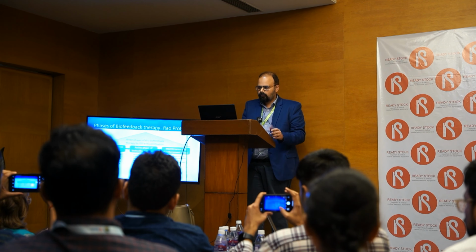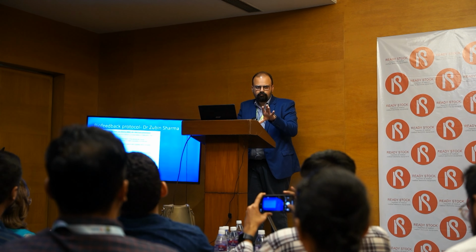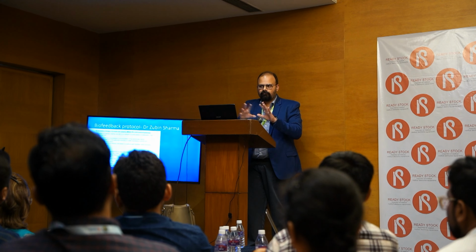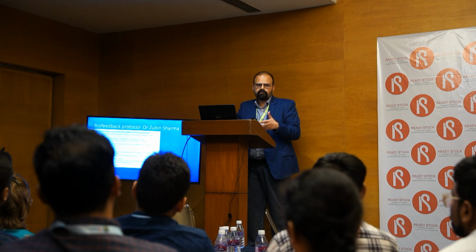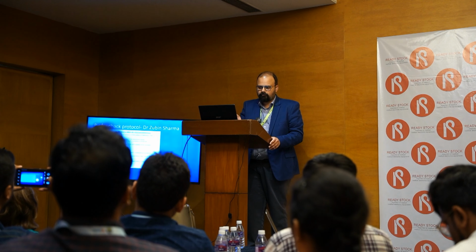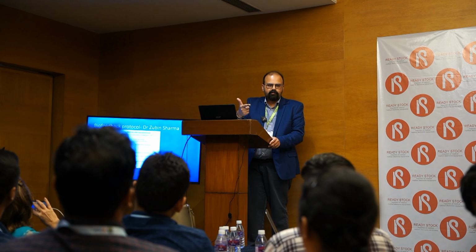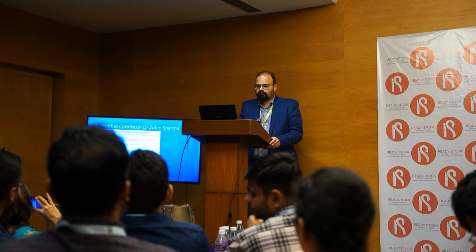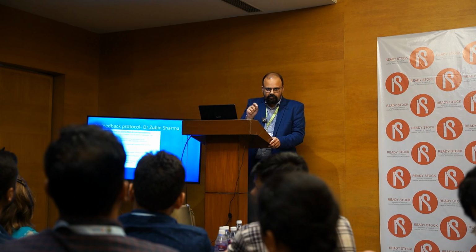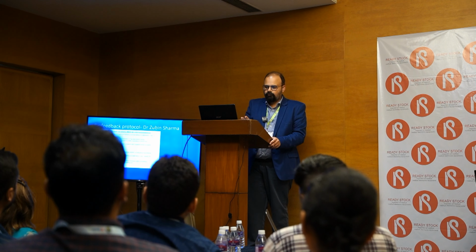That part is usually over, but yes, it's something which we have to reinforce when we are doing each and every session. So when I read all of that, I made this protocol. This may not be a very correct protocol for everybody, but it's what works for me in my practice. I went through all the articles and what works for me. So first of all, I tell the patient what is biofeedback and what we are going to do on a biofeedback, how biofeedback is going to help you. If your patient is educated enough, he will understand the whole logic behind it and what to do.